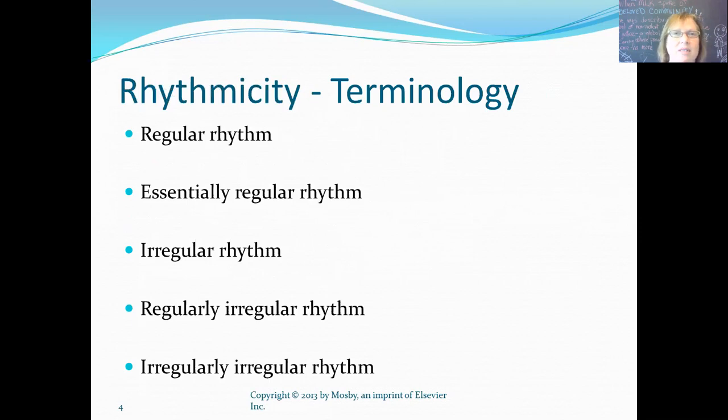We'll talk about blocks a little bit at the very end of this series on cardiac interpretation. But whether it's regularly irregular or irregularly irregular becomes obvious over the course of time. So I just wouldn't waste your time on it now, because it all becomes too much to remember, and it's not particularly helpful. So don't even worry about that.